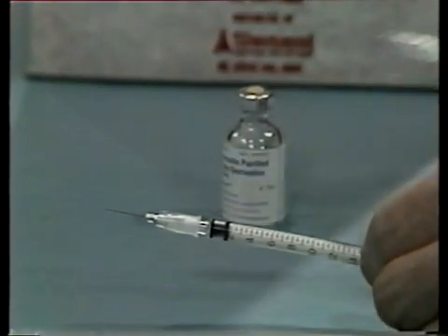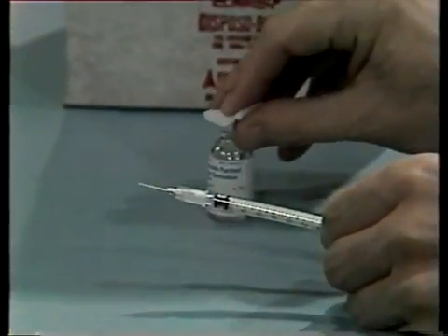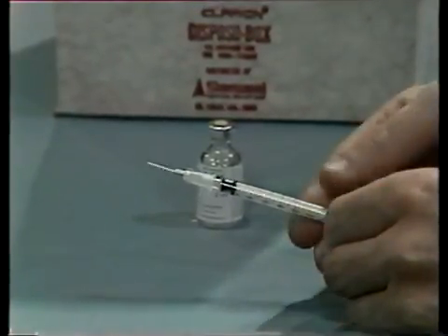You prepare the needle and syringe in the same manner as you would for other injections, except that you should use the smaller tuberculin syringe.